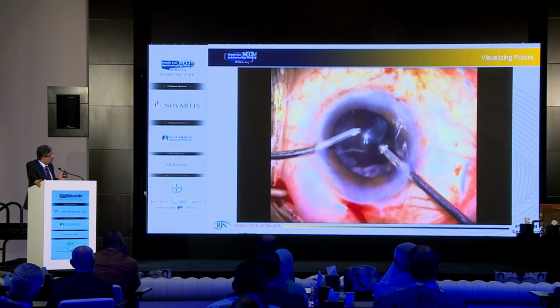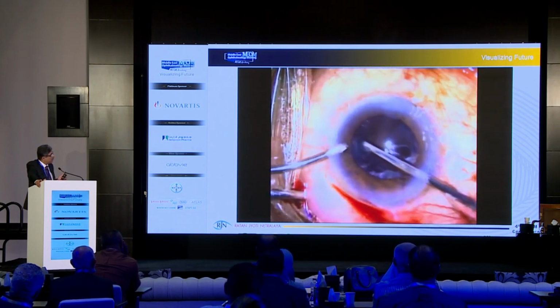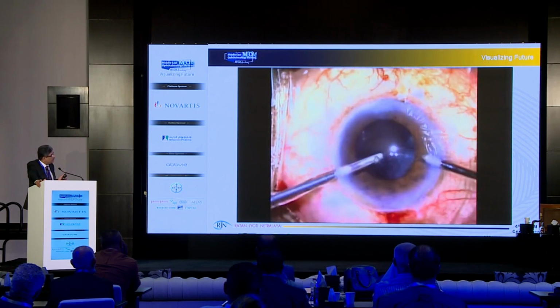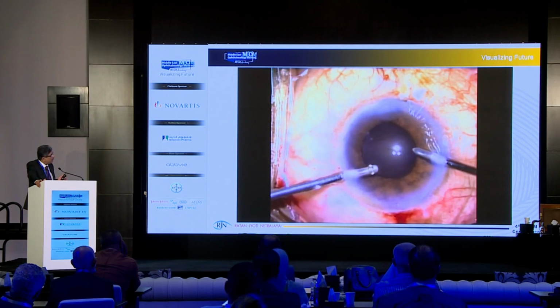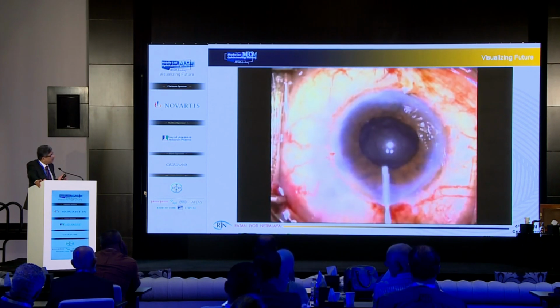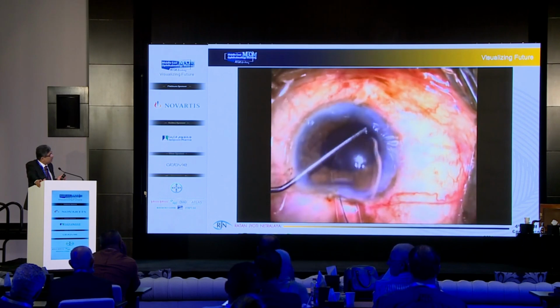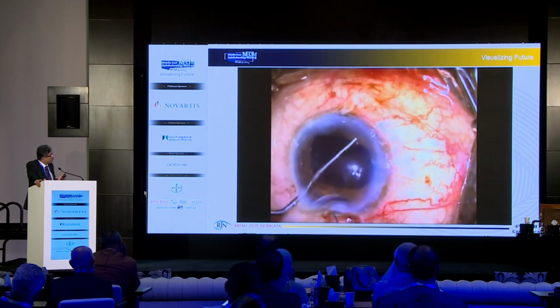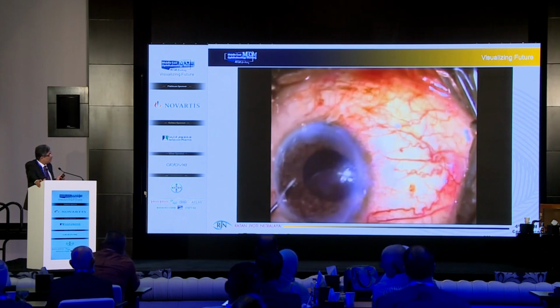Again, to emphasize, taking the help of the vitreous cutter, we are removing the epinucleus and the soft cortex. There is a rent. Fill the chamber with viscoelastic, place a 3-piece lens in the sulcus. This is guided by the Lister hook.